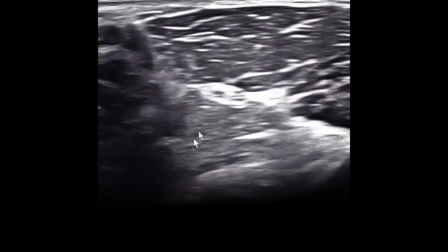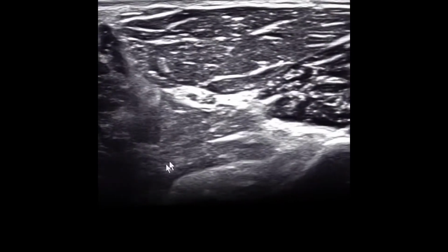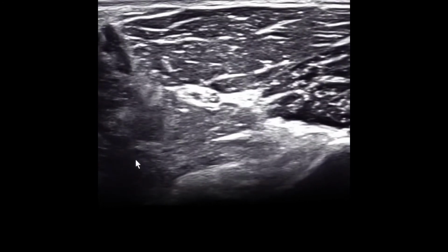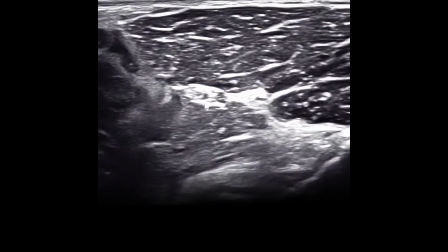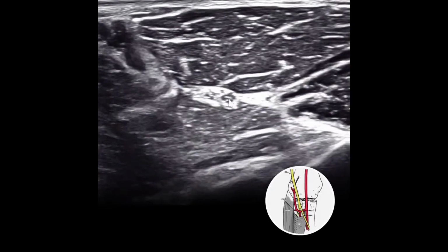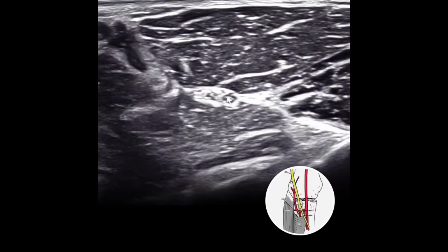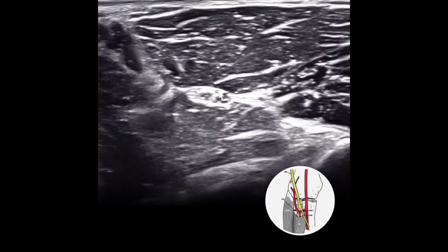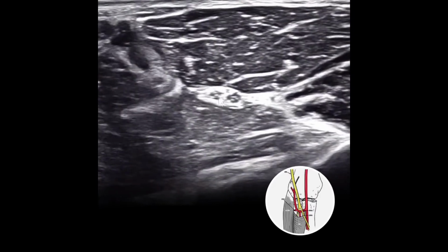Alright, so here we are with the ultrasound, high resolution, fantastic for the nerves. So we are here in the lateral elbow crease, in front of the elbow, a little bit outer part. And this structure is the radial nerve. We're slightly above the elbow crease. And you can see a very beautiful appearance of the radial nerve. You could see those black, the fascicles of the nerve, and you see the connective tissue around, the perineurium, epineurium, and so on. Beautiful appearance.